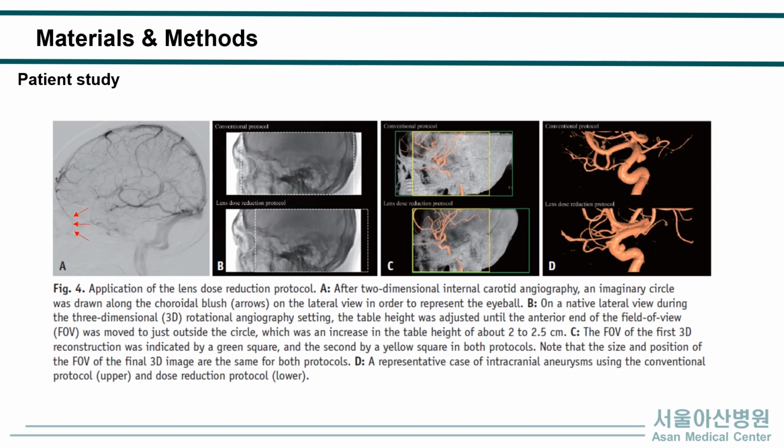Figure C shows the FOV of the first 3D reconstruction, and Figure D shows a representative case of intracranial aneurysm using the conventional and lens dose reduction protocol.